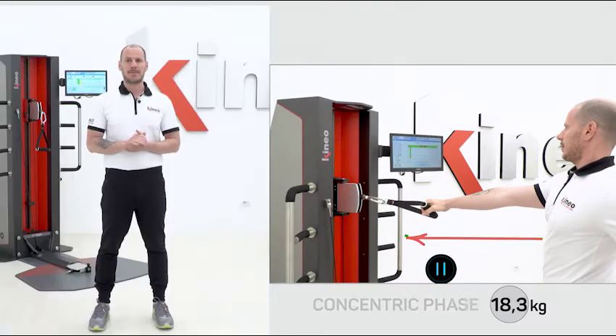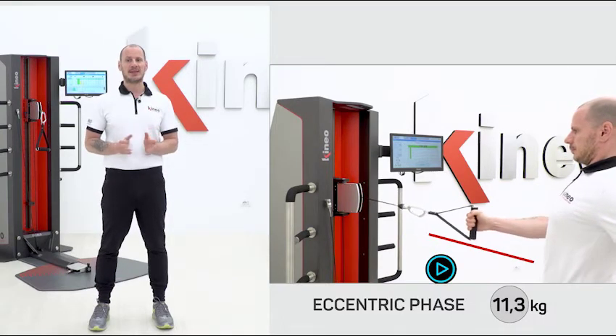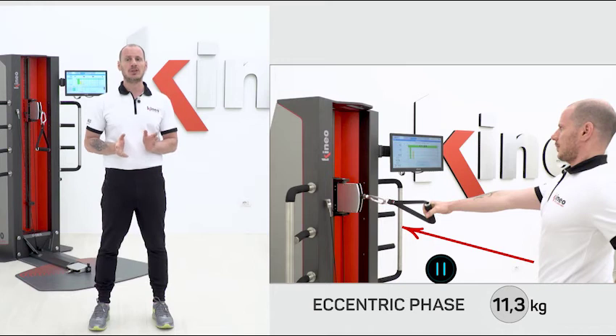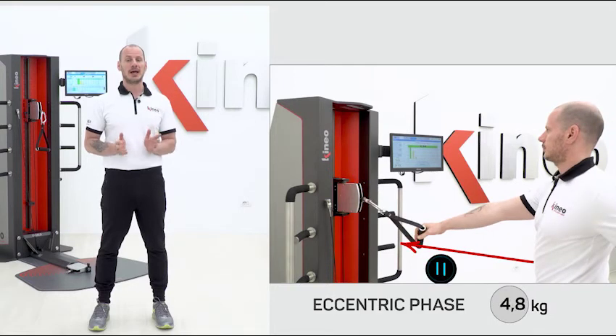If I resist less, so with a higher return speed, the load will be lower: 11.3 kg. If I had a problem or felt pain for any reason and I let the load go completely, Kineo would help me by putting the load to zero and facilitating my movement.